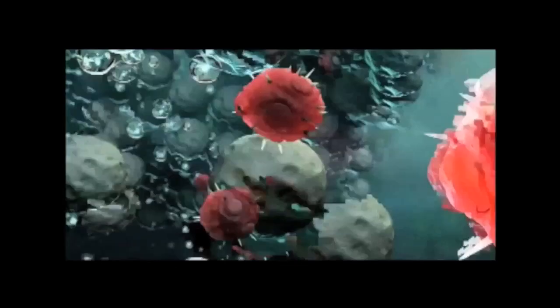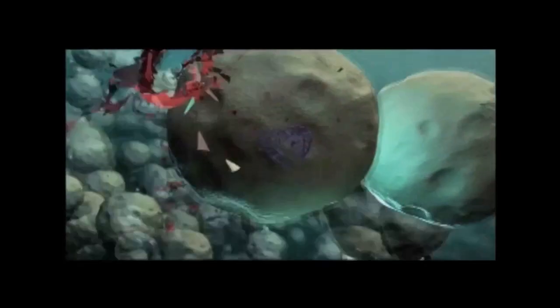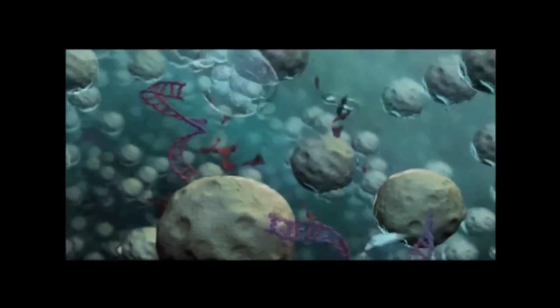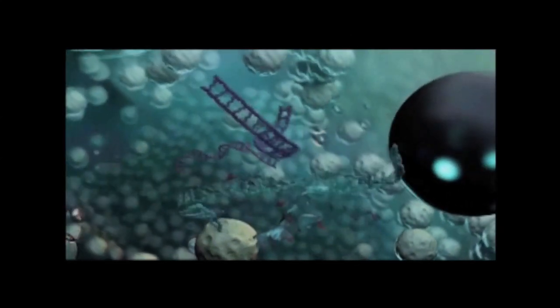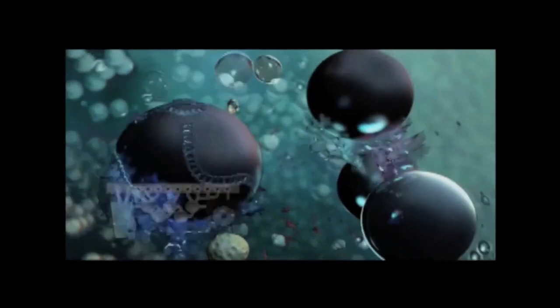First, the sample is moved into the lysis chamber where the FilmArray physically lyses any cells and viruses through a process called bead beating. Ceramic beads are agitated at high speed to break open cells and viruses and release the nucleic acids. These nucleic acids are then bound by magnetic beads, which are then moved from the lysis chamber to the purification chamber.